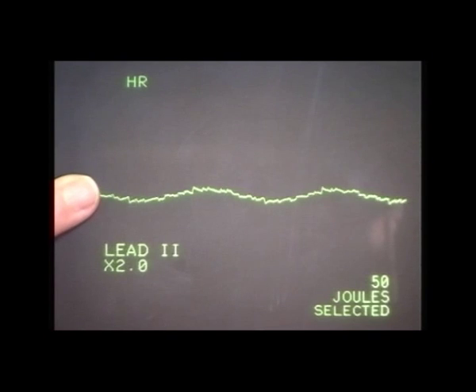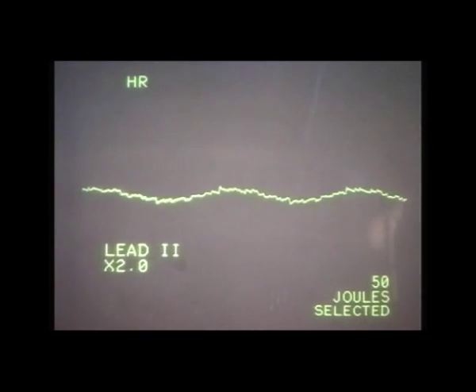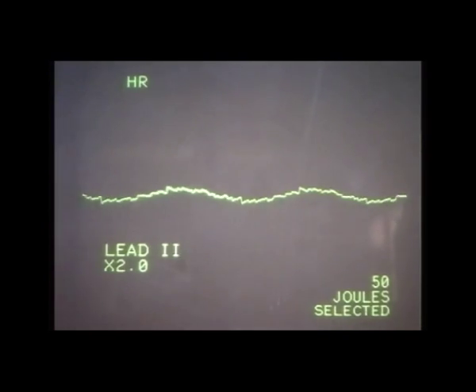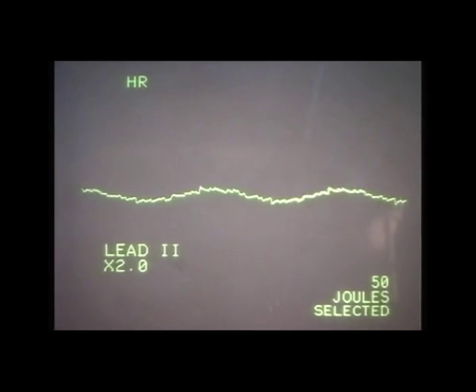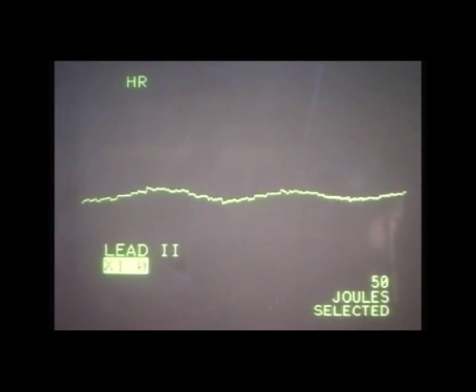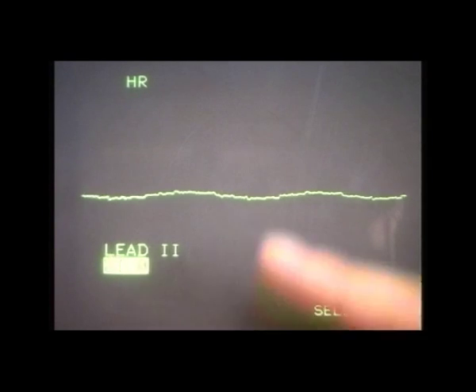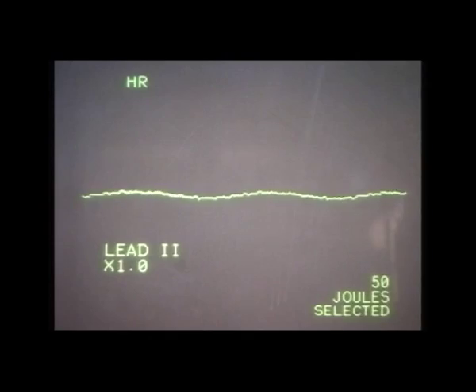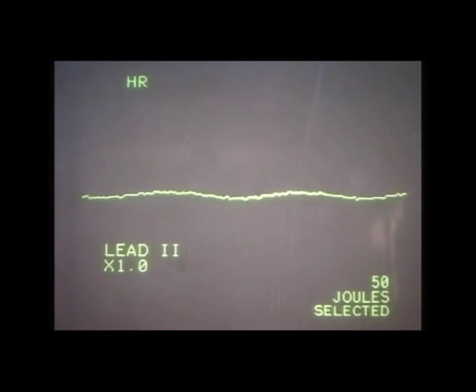So, these fine deflections represent myocardial fibrillation? It does, yes. And what would it look like if it was a pure asystole? What we would see would be a completely flat line, although it's difficult to see on this monitor, but a wandering baseline. What we'll see if the leads are off is a completely flat, straight line.